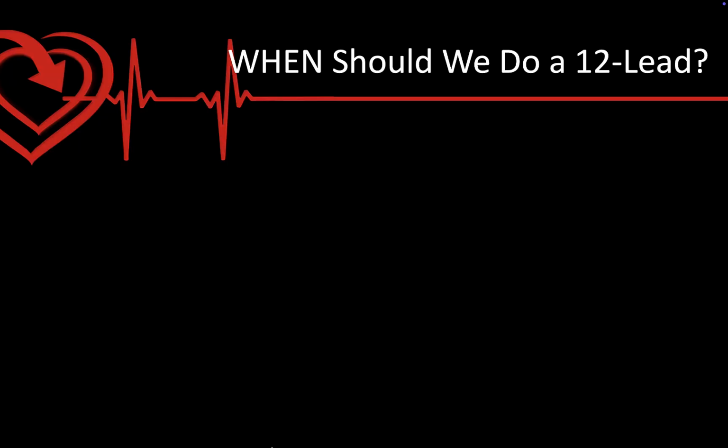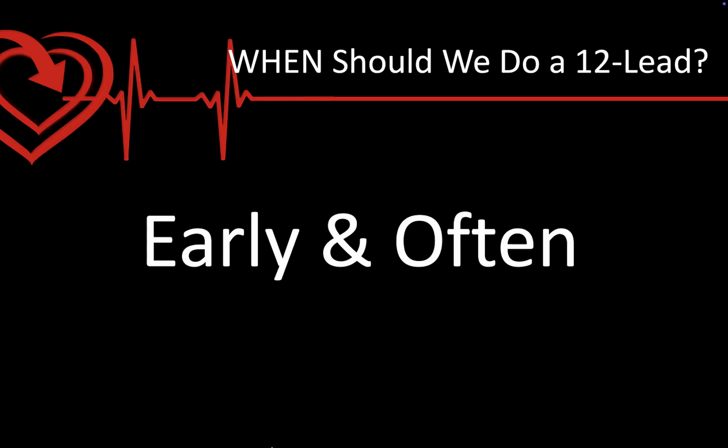So when do we do a 12 lead? The simple answer is we should do it early and we should do it often. Anytime we suspect a cardiac etiology with our patient, anytime we suspect there may be a possibility of infarct, we should do it.